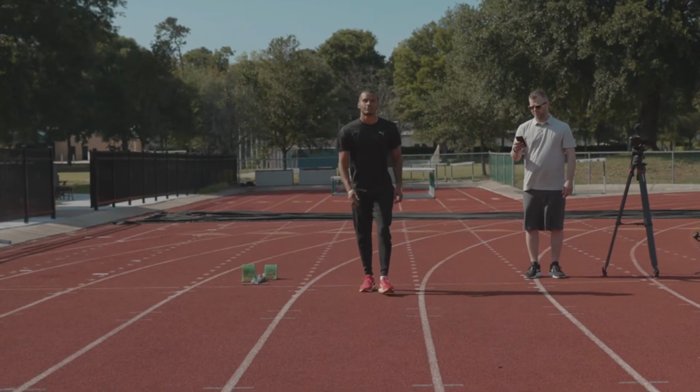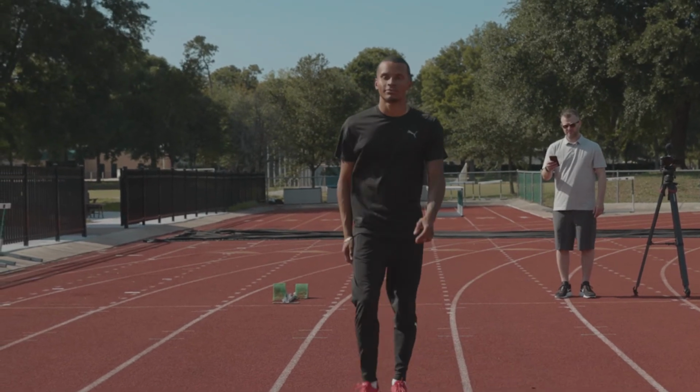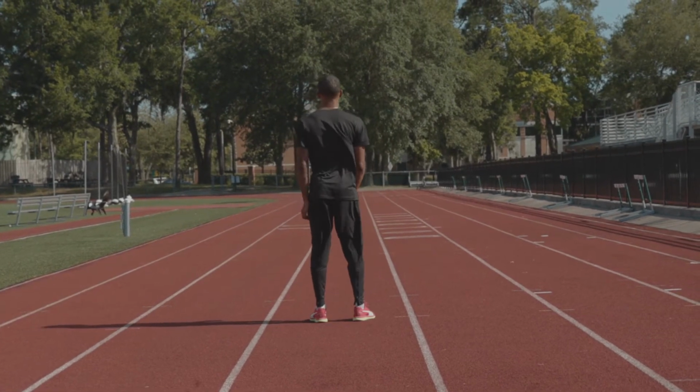Perform the walk test over 20 meters. Open the Plantiga web app, locate your athlete, select the walk test, and hit record. Instruct your athlete to stand still for 5 seconds before starting the walk test. The athlete begins the test on your command and walks with their self-chosen gait strategy until the 3rd cone. Have the athlete stand still at the end of the test for 5 seconds.